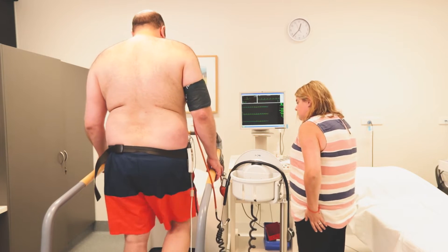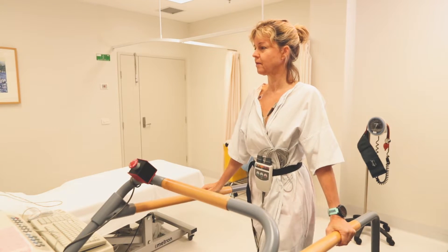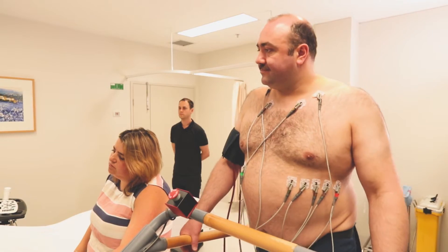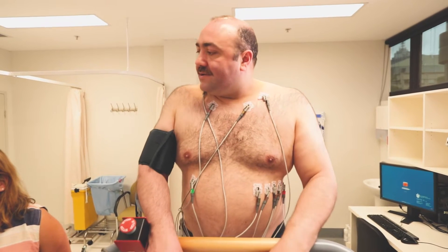The test starts slowly and gets faster and steeper every three minutes. Blood pressure will be taken at each stage. It's a symptoms-based test where you tell us when you've had enough.